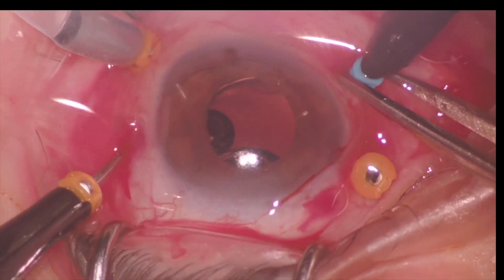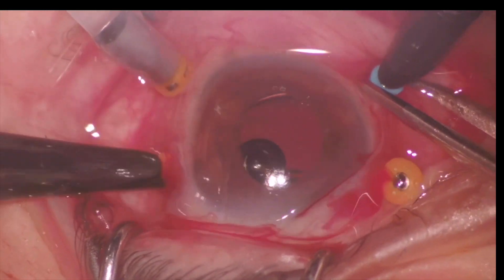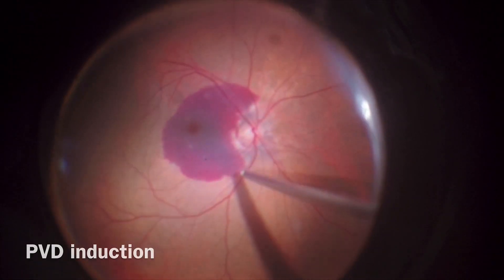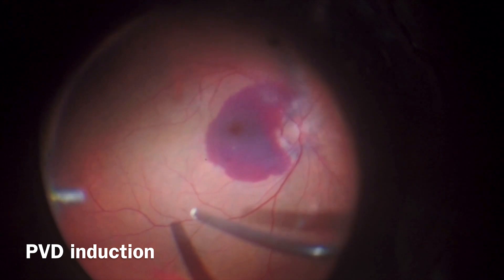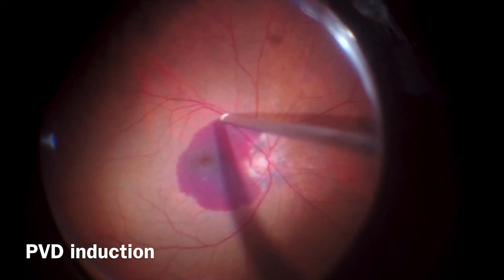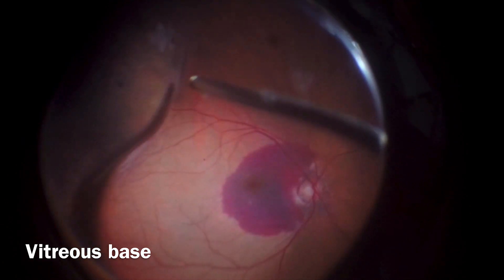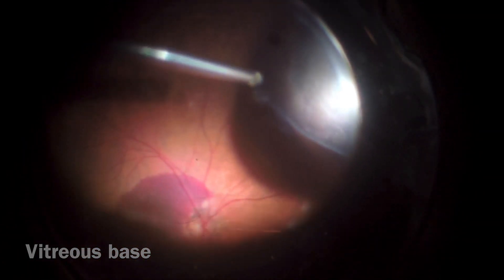Submacular hemorrhage is an important cause of irreversible visual loss. Nowadays, massive hemorrhage is generally managed with PPV and injection of TPA into the subretinal space. In this video, we show an adaptation that allows better control injecting the correct doses using the viscofluid control unit of the Constellation system.